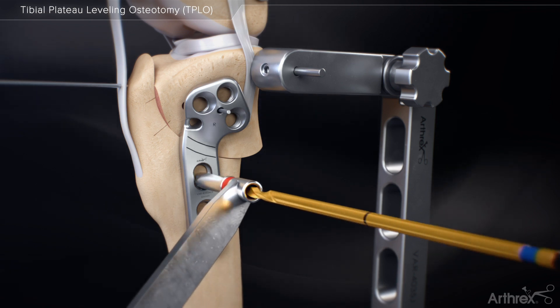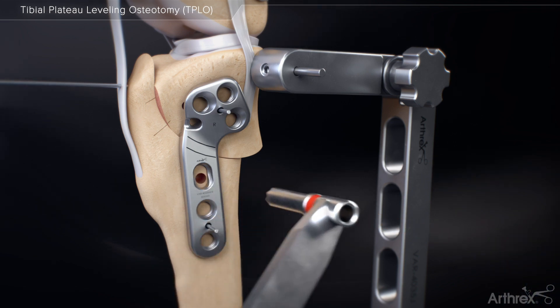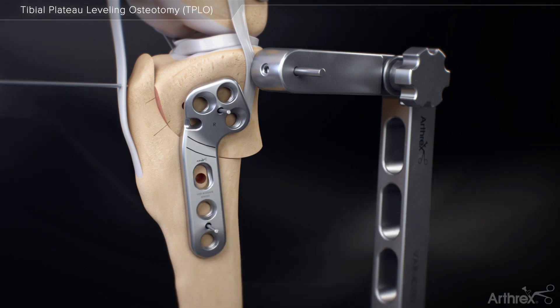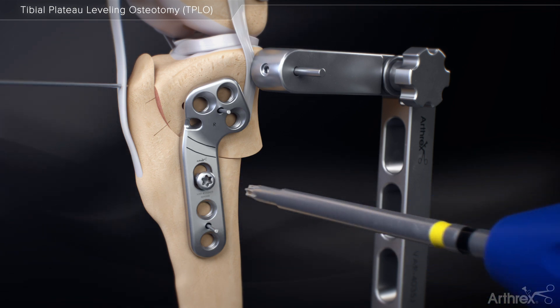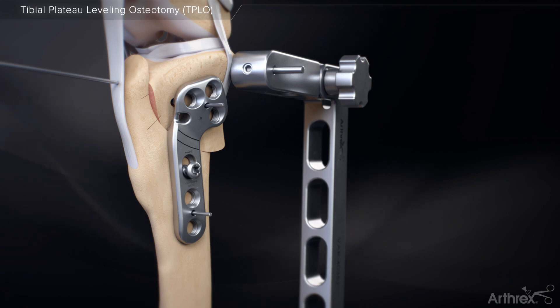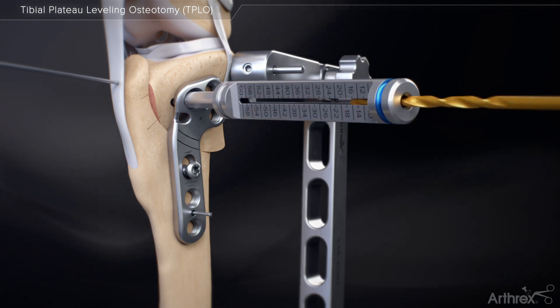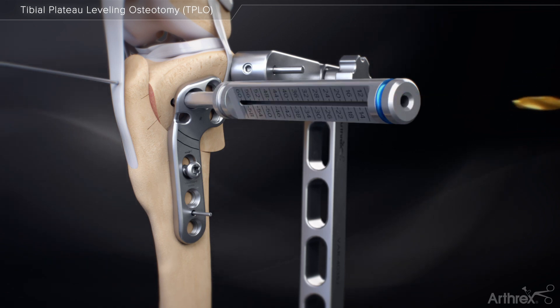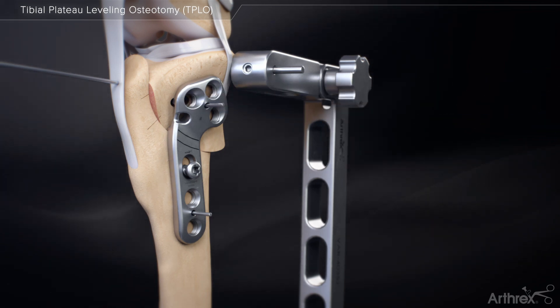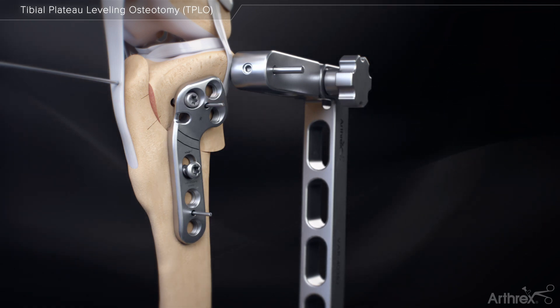Use the appropriate size drill guide and drill bit to create a hole in the compression position. Insert a non-locking cortical screw in an eccentric position to allow for compression. This screw should be left slightly loose but in contact with the plate. Screw the locking drill guide into the first proximal hole and drill the hole. Measure its depth to the appropriate length, or alternatively use the traditional depth gauge included in the instrumentation set. Place locking screws in the proximal fragment, ensuring not to lock the screw under power.